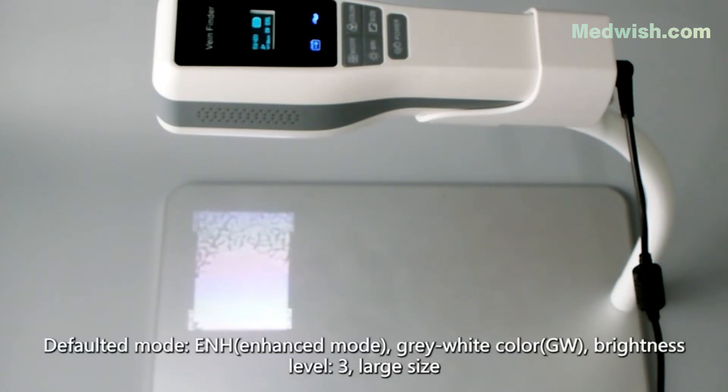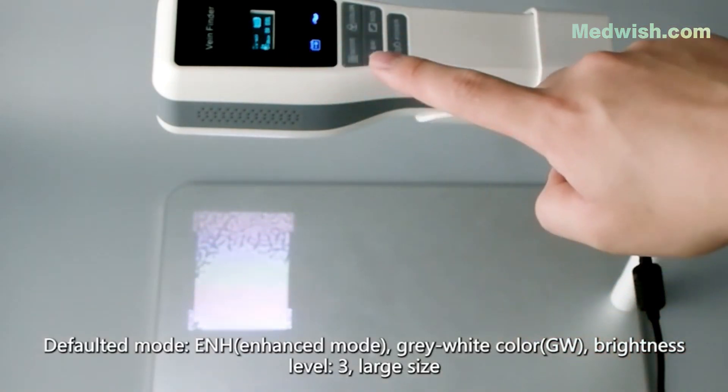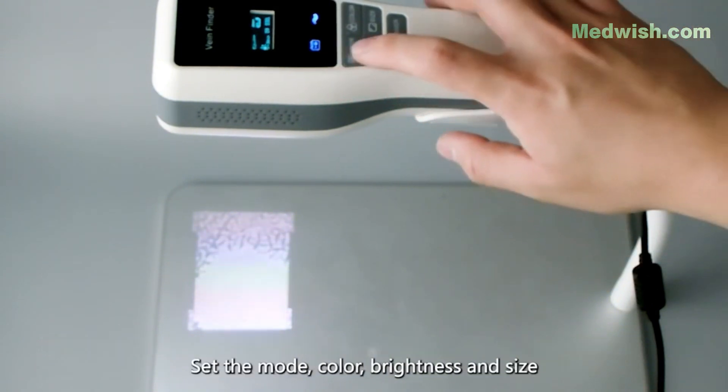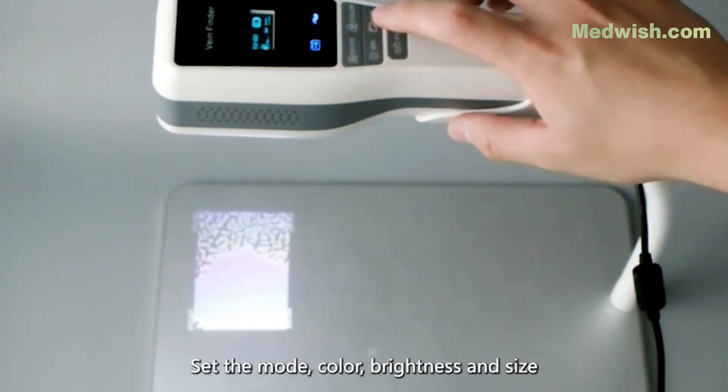Set the defaulted mode and enhanced mode, grey-white color (GW), brightness level 3, and large size. Set the mode, colour, brightness and size accordingly.